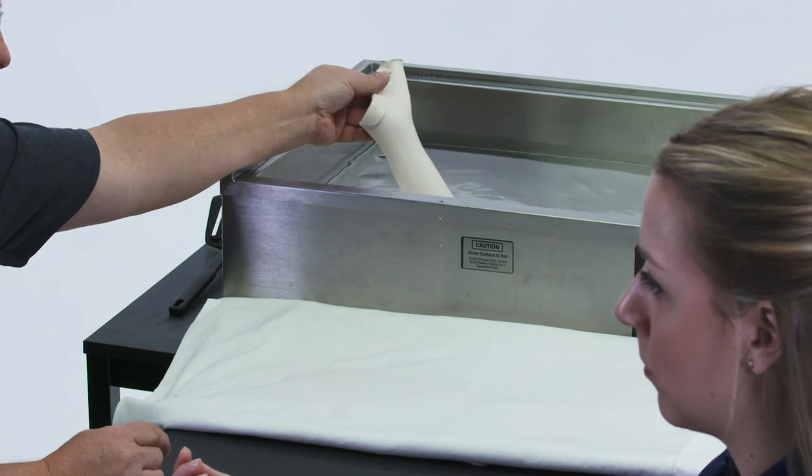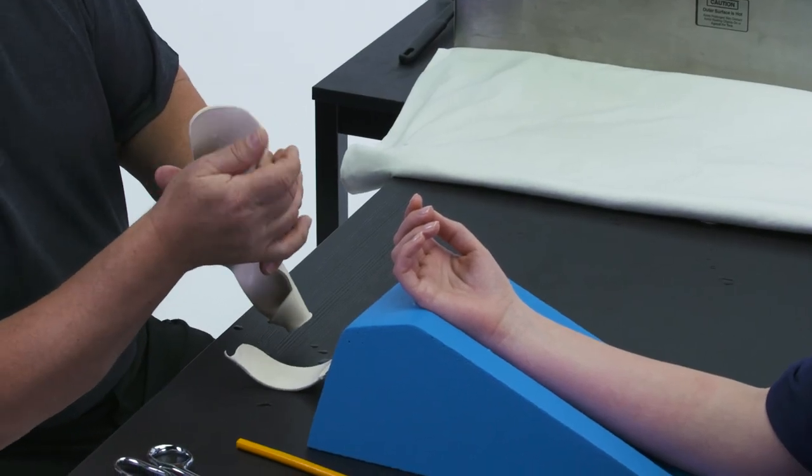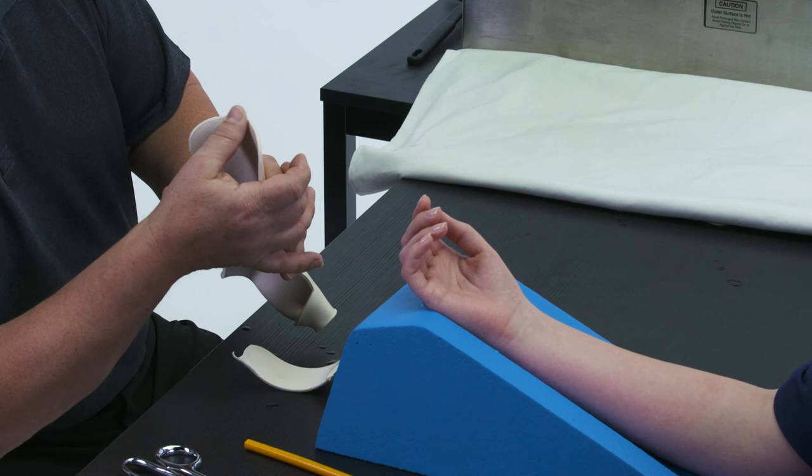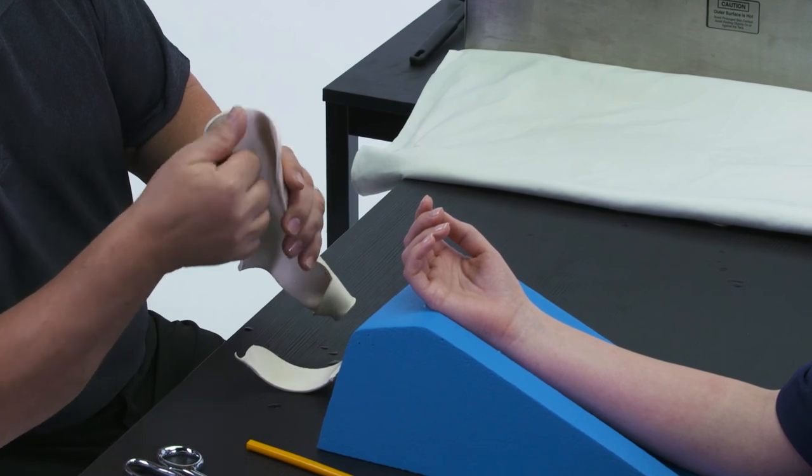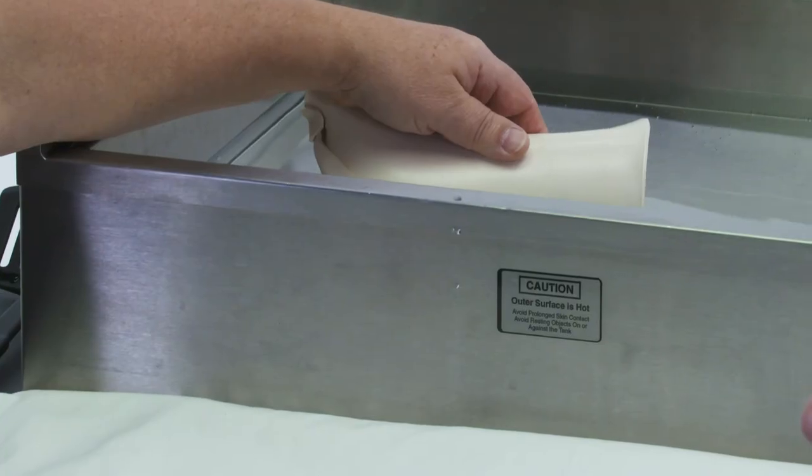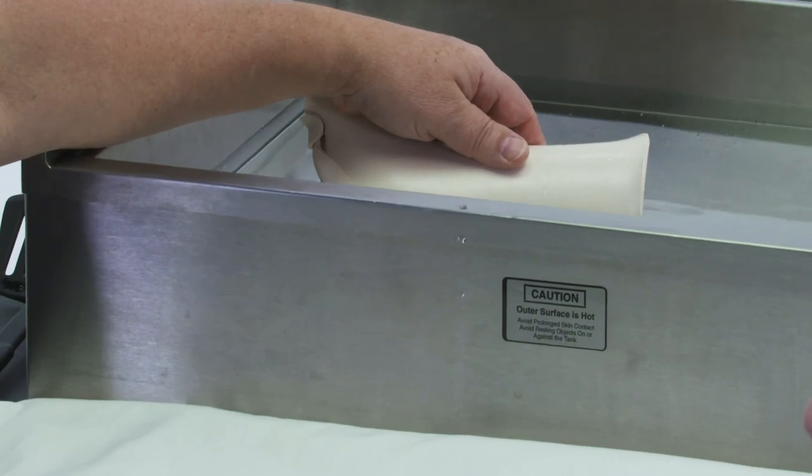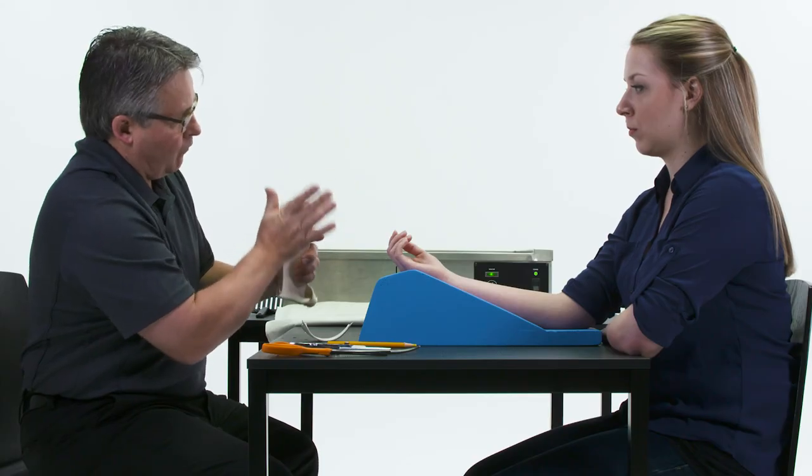Gently flare the proximal border of the splint. The flare does not need to be dramatic. The intent is to lift the proximal border off the forearm, reducing pressure. Dip remaining edges into the splint pan for 20-30 seconds and finish the edges with your palm.